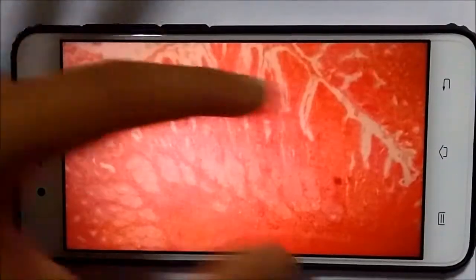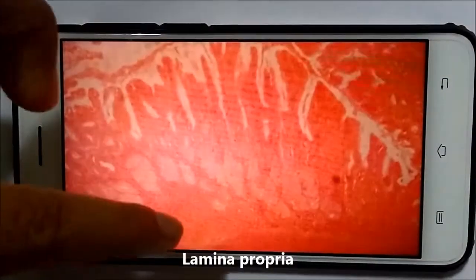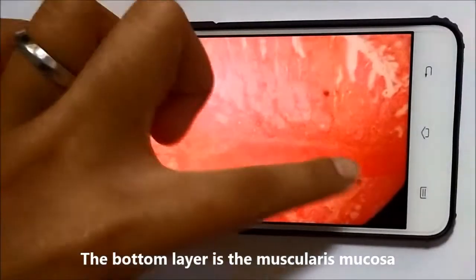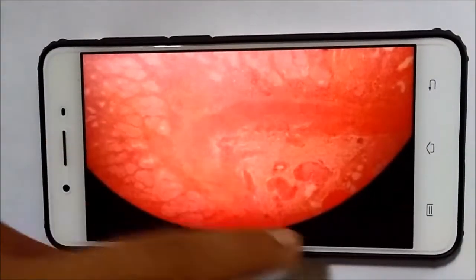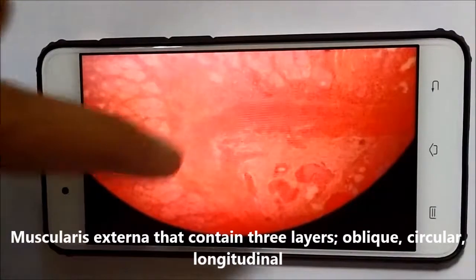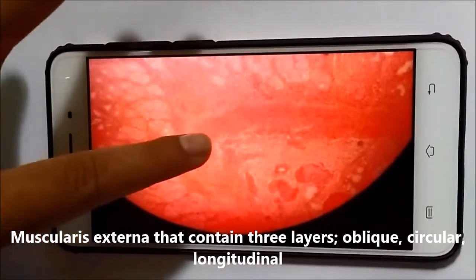The part along here is the lamina propria, and the bottom layer here is the muscularis mucosa, and under the muscularis mucosa is the muscularis externa, which contains three layers, which are oblique, circular and longitudinal.